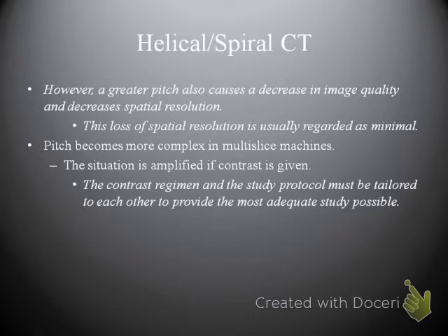Pitch becomes more complex in multi-slice machines, though, which we won't get into for the helical portion for protocols, because this is kind of beyond our scope. But for those of you who are in CT physics, you will understand how complex this actually has become because of multi-slice.